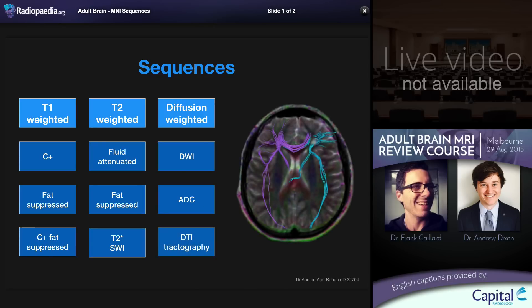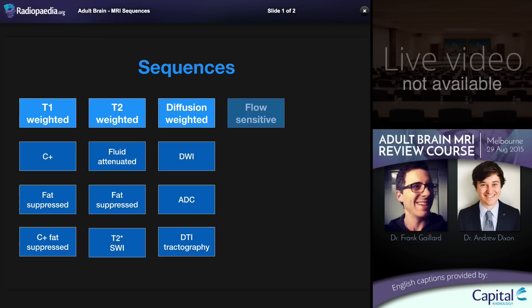An extension of diffusion is diffusion tensor imaging, which allows tractography — whereby the restricted motion of water molecules along white matter tracts enables tracking of those tracts from one part of the brain to another. Here we can see white matter tracts crossing from one frontal lobe across the corpus callosum to the other, as well as extending posteriorly. Although tractography is relatively frequently performed in academic institutions it's still not really mainstream, with its role being largely research-based, though it is finding increasing roles in operative planning.